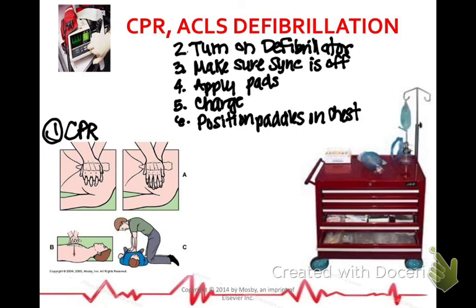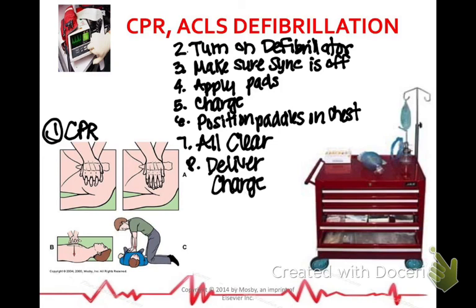Apply your pads, charge, position the paddles. Remember, you got to say all clear, everybody clear. You don't want anybody to get shocked. And then you deliver your charge. Like I said, I got just a little algorithm there from ACLS. You're not responsible for it, but I just wanted you to see how it looks on this next slide.